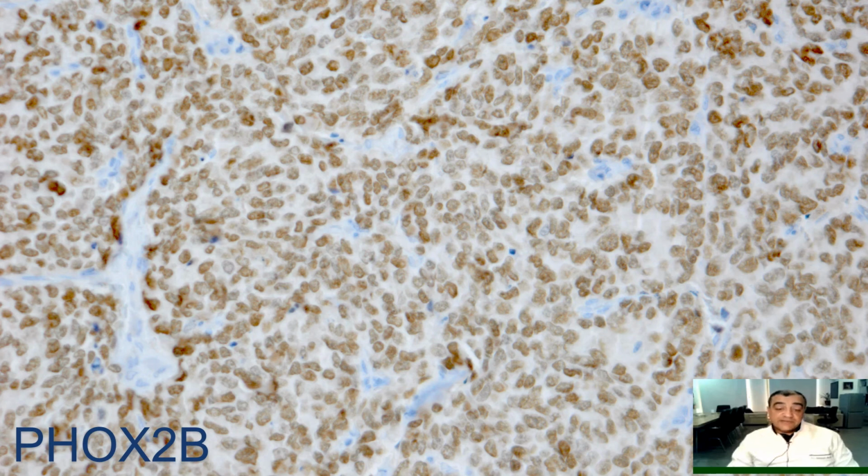I found this a very interesting field in pediatric pathology, and I suggest all pathologists and residents that work in the field of pediatric pathology start to use this antibody in case you have to recognize ganglion cells in Hirschsprung disease also.